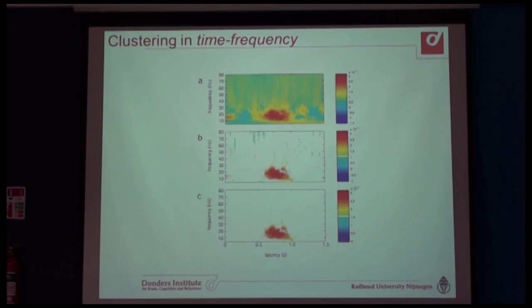So let's now look at the time frequency data. This is one of the results from the hands-on session that you did yesterday morning. This is, again, a hand-picked channel. We have the time frequency domain. And now plotting gets a bit more difficult. But what we can do is, again, compute a t-statistic, and threshold the t-statistic to get a binary image. What I'm showing here is the effect thresholded using the t-statistic without correcting for multiple comparisons.